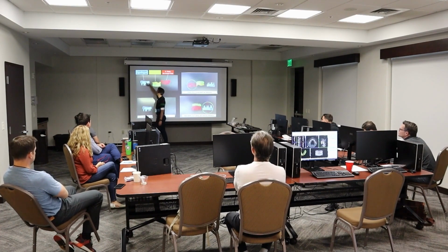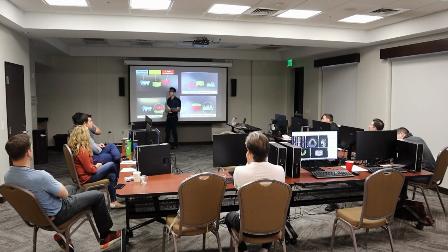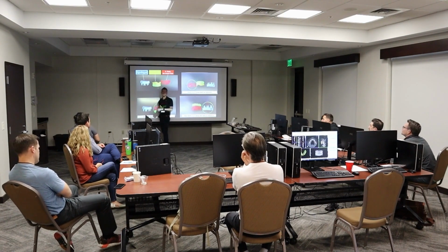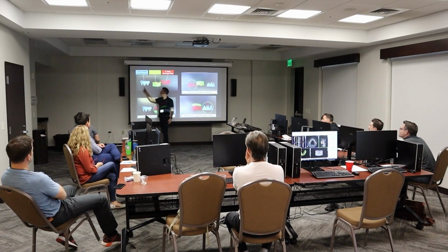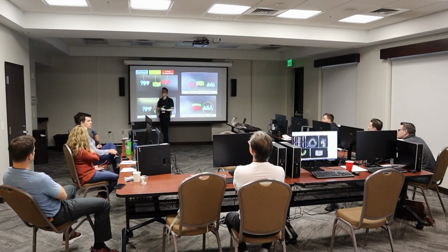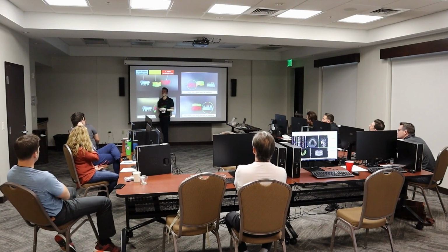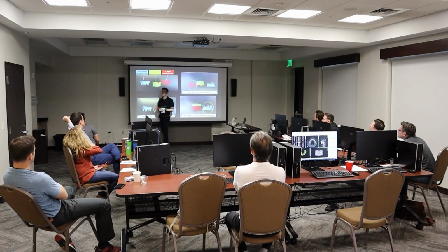Scan number 1, you have a master cast with scan bodies on it. This is the one that your lab can do, right? Because this is the one that has to be done with a box scanner, that master cast with the scan bodies on it. Those are lab scan bodies. They're different than the ones you're going to use in the mouth. That's an important distinction. They're plastic or PEEK or whatever. They're like yellow, off-white, kind of a taupe color, right? So those are lab scan bodies.